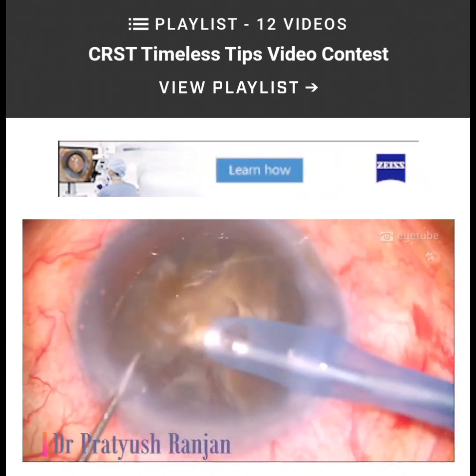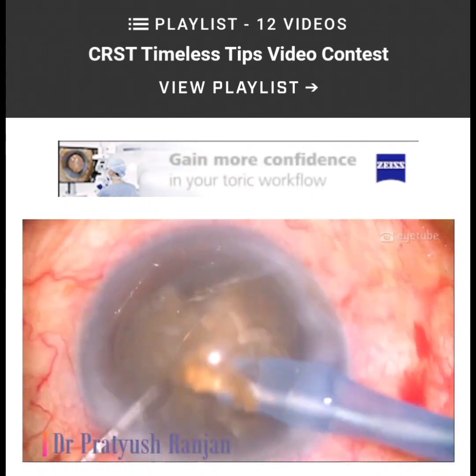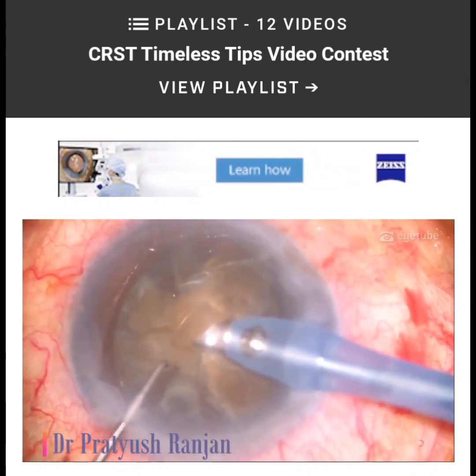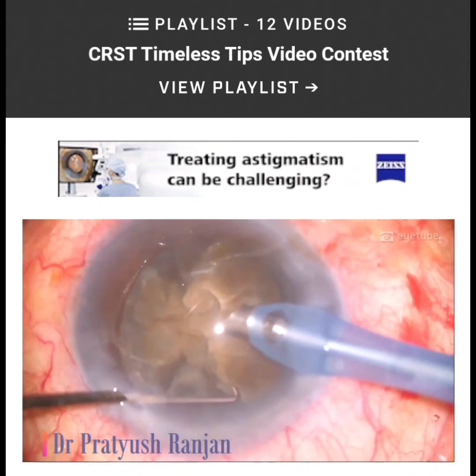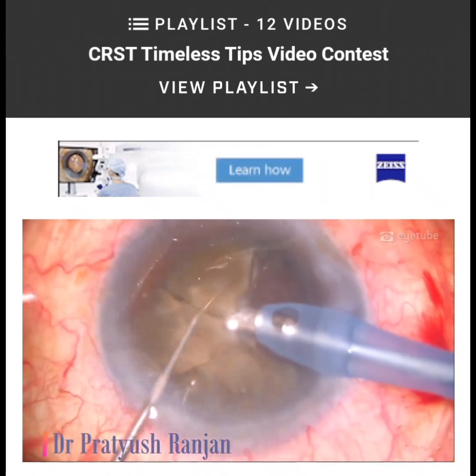So this emulsification is going on in the bag. You are not near the capsule, you are in the mid bag or just at the pupillary plane level. So that makes you safe.